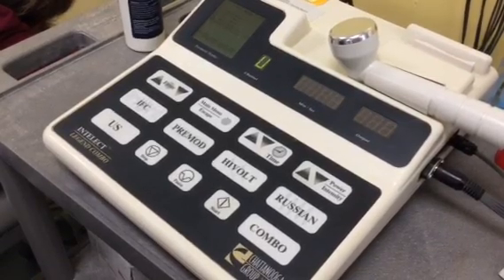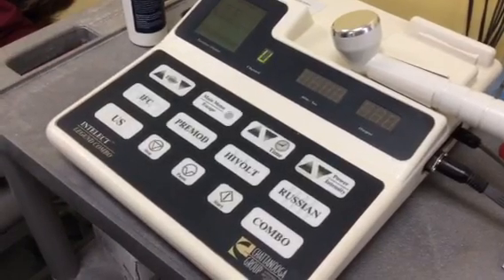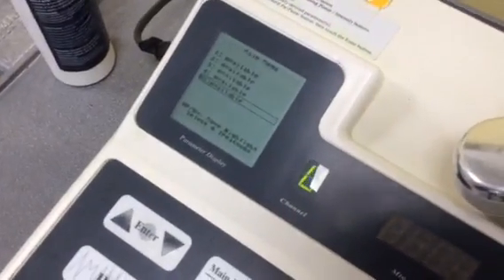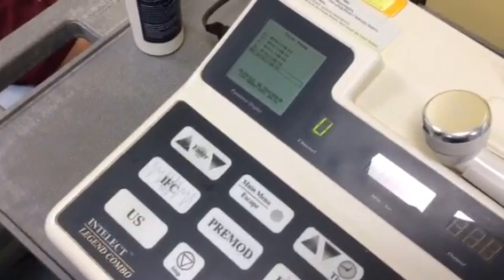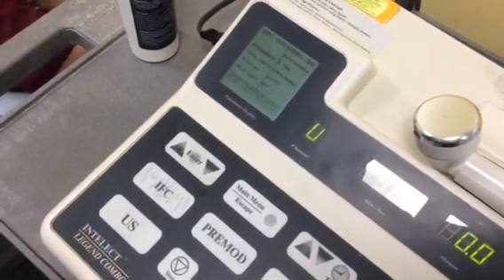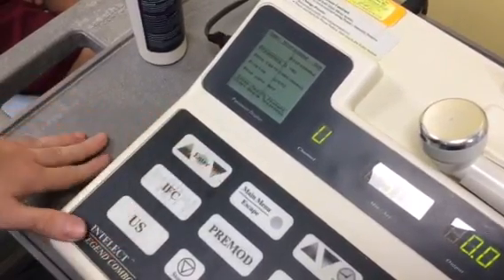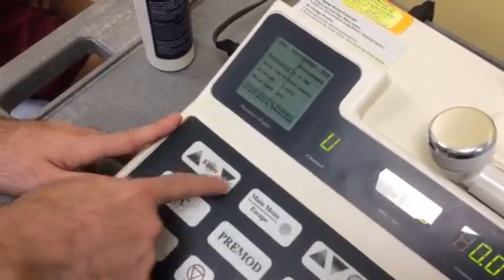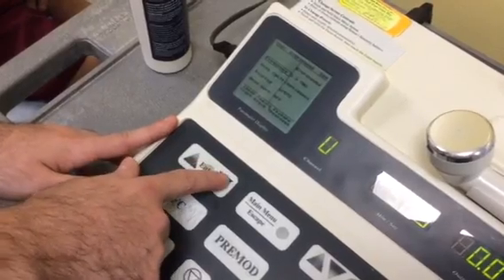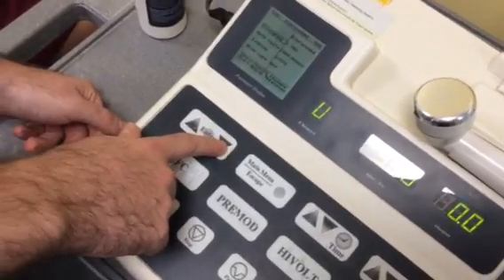We're going to go ahead and show you how to set the ultrasound. This is our ultrasound machine down in physical therapy. The first thing you're going to do is press the ultrasound or US button, and that's going to bring up our menu. The very top thing talks about frequency. You can see we have 1 MHz, and if you press enter it can switch to 3.3 MHz. It depends on the depth of the tissue we're trying to treat — 1 being deep and 3 being superficial.